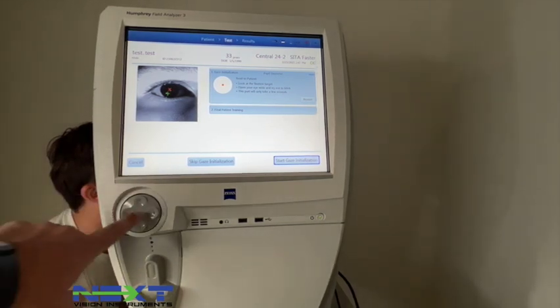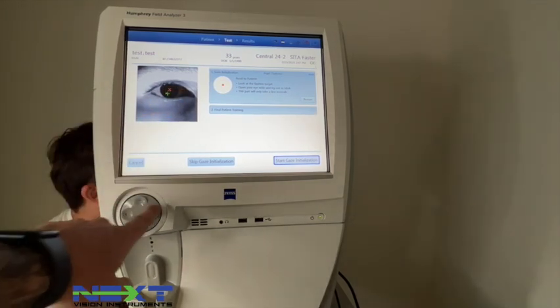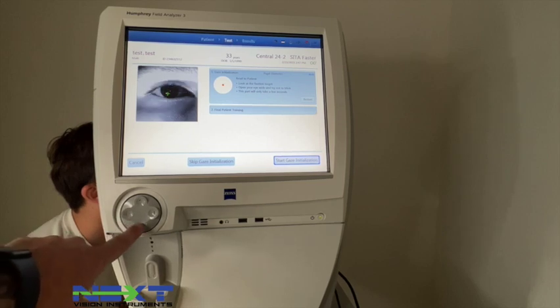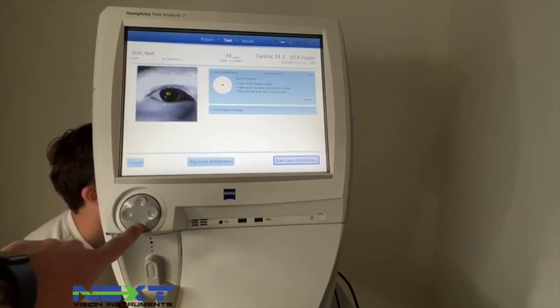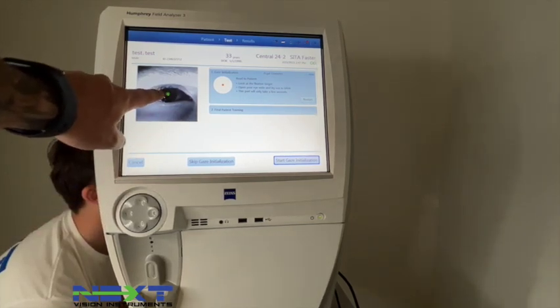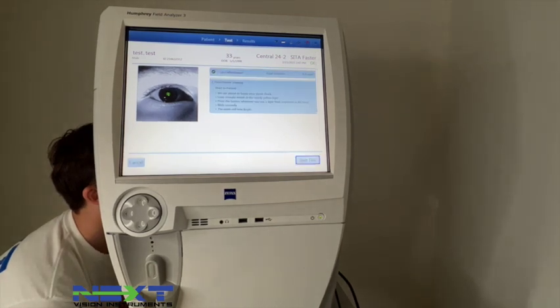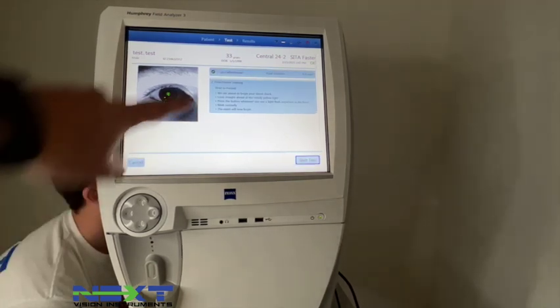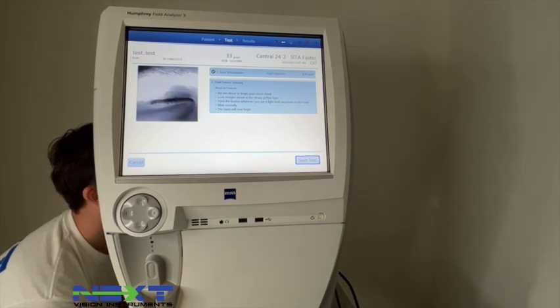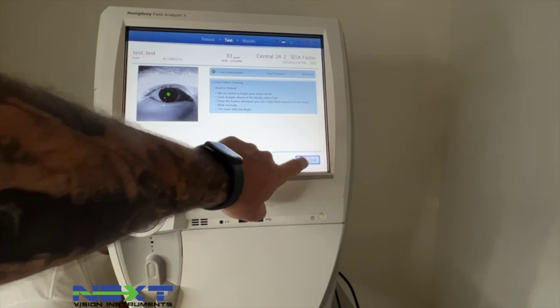When testing the left eye, their chin goes on the white side — the right side. After adjusting the table height, use the directional pad to move the eye alignment. We want the eye to come down a little and to the left until the cross turns into a star. Select Gaze Initialize and it will instruct the patient: look straight ahead at the steady yellow light, press the button whenever you see a flash anywhere in the bowl, blink normally — the exam will begin now.